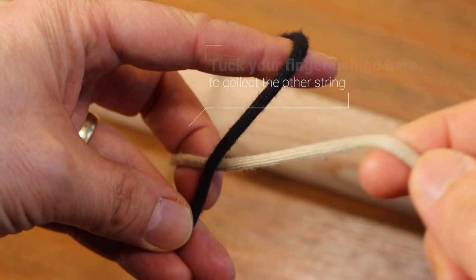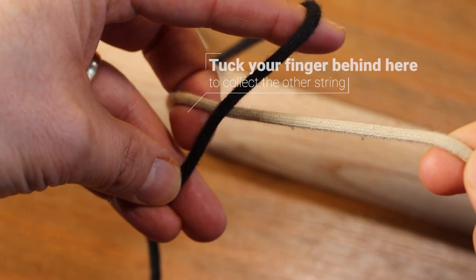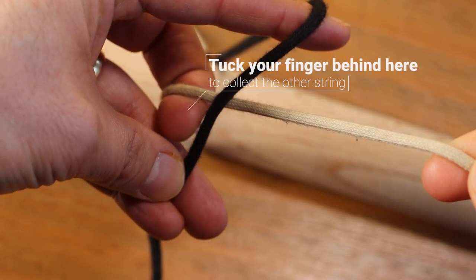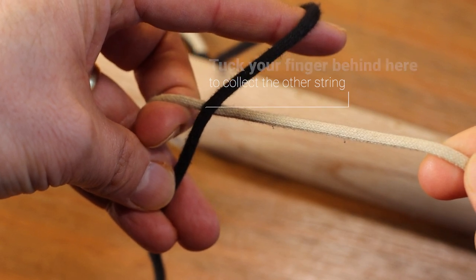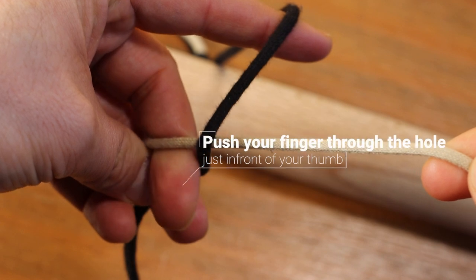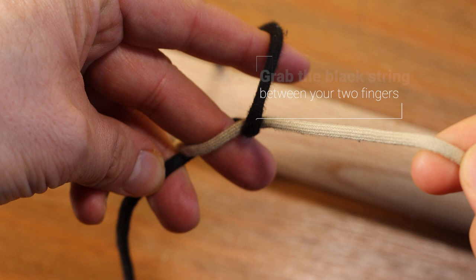So now what you're going to do with your spare second finger is curl it around the white string like that, just in front of your thumb and ring finger, and once it's gone through behind that black string, you're going to need to push that second finger through the hole and then slowly straighten up that finger.